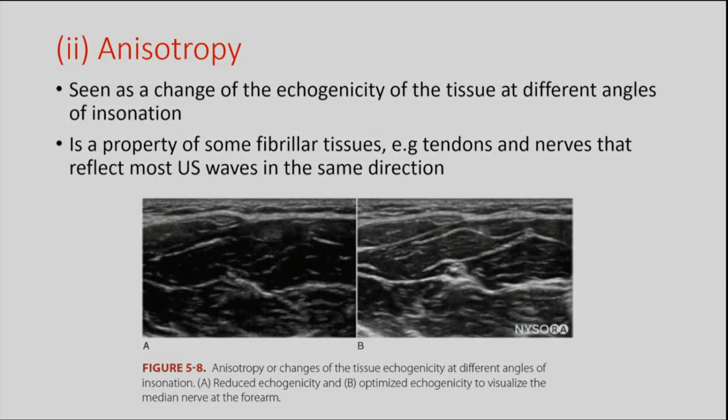Any questions? Of course, when it comes to vascular access, color can be useful, but most of the time we do not particularly use it. But let's say if you want to use it, for example in DVT scanning, then color Doppler can be useful. Not really to identify where the vessel is, but actually to see whether there's actual flow.